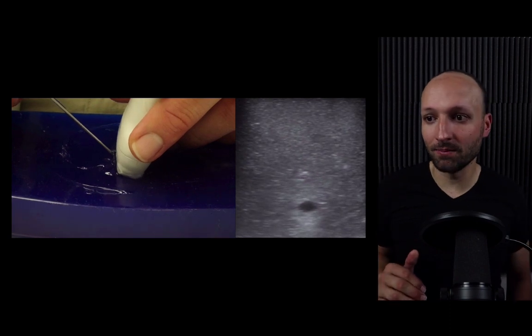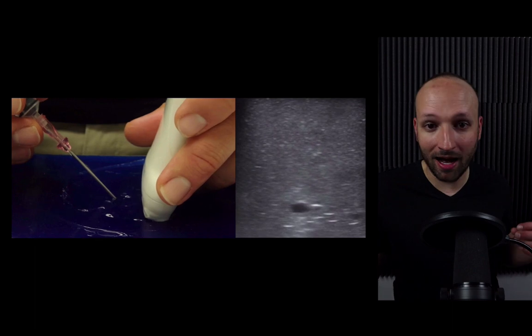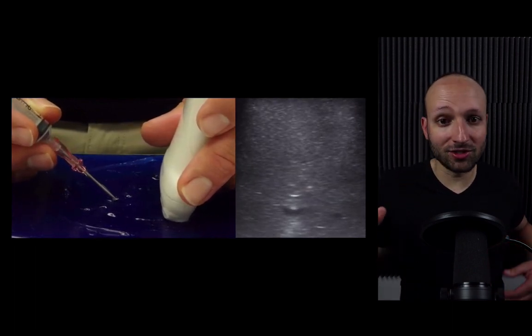And here is me doing that technique on a very small and far away vein. You can see I'm not moving the two things at the same time. I'm moving them sequentially. Now, this is just basics.